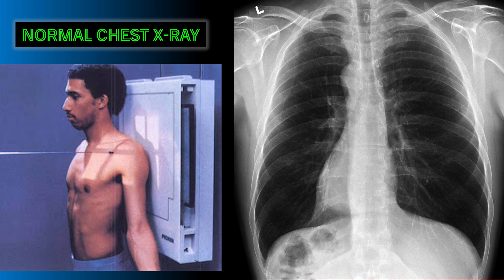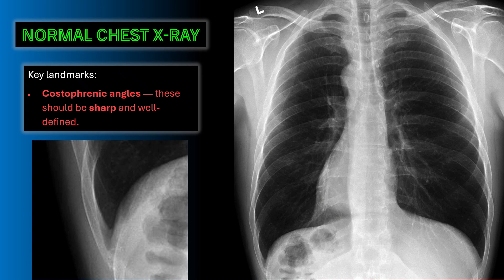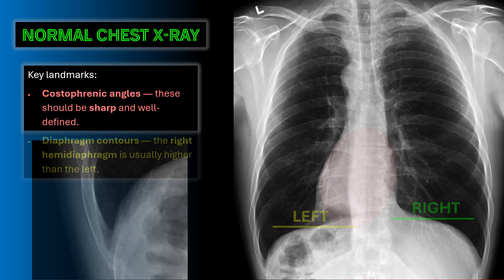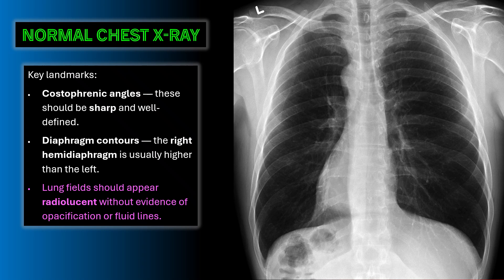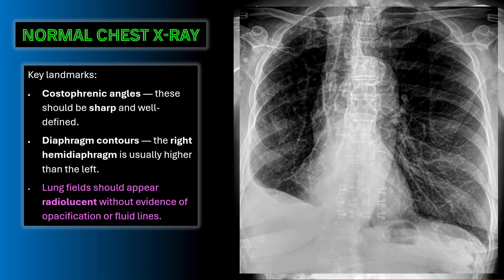Let's first review what a normal chest x-ray should look like. The costophrenic angles should be sharp, well-defined, and free of any fluid. When we look at the contours of the diaphragm, the right hemidiaphragm is usually higher than the left due to the heart pushing down on the left side. The lung fields should appear radiolucent without evidence of opacification or fluid lines — keep this in mind as we move into pathology.